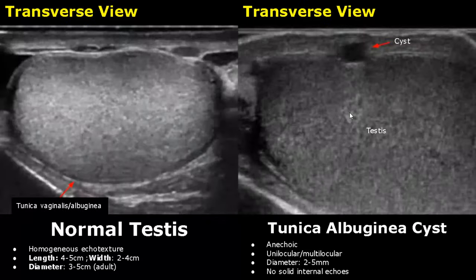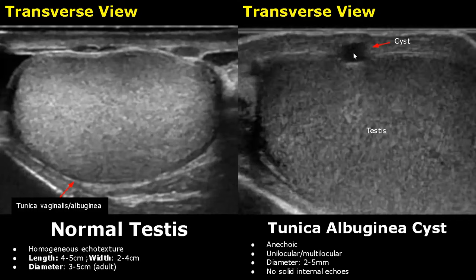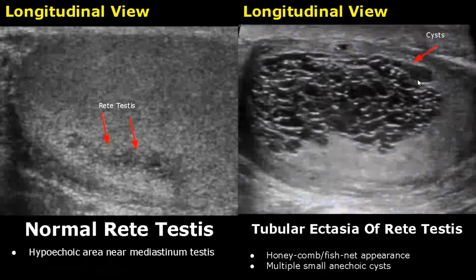Tunica albuginea cyst is a small anechoic cyst in this layer, which may be unilocular or multilocular — meaning it can have septations. The diameter is between 2 to 5 millimeters and there are no solid internal echoes.